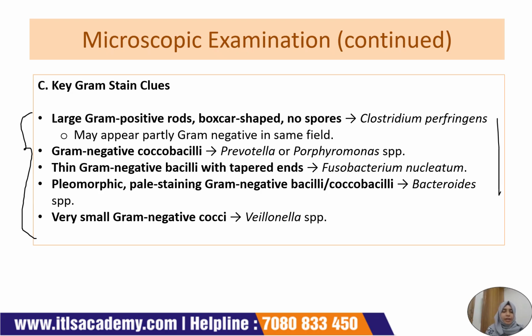For gram-negative coccobacilli, Prevotella or Porphyromonas species are considered to be present. Thin gram-negative bacilli with tapered ends show Fusobacterium nucleatum.